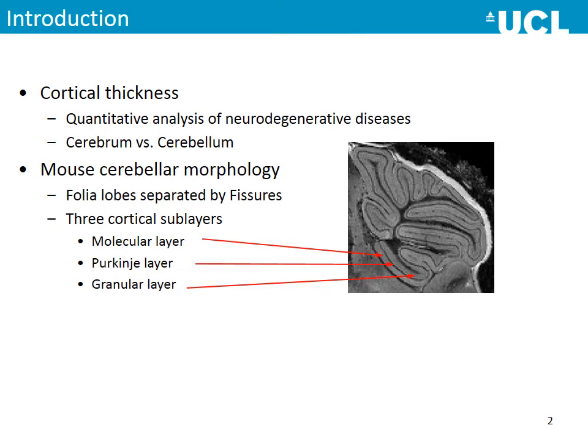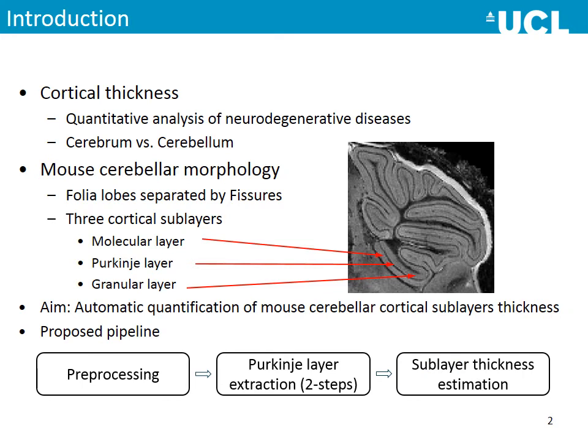So the aim of our study is to derive a framework to estimate the thickness of the molecular layer and the granular layer, and this is achieved through extraction of the middle Purkinje layer.